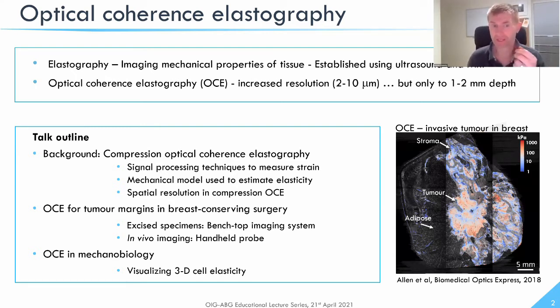In the second half of the talk, I'll then describe some of the work we've been doing to perform margin assessment in breast conserving surgery, and just touch on something which is a little bit more recent, but something that we're accelerating quite a lot in the group, which is to try and apply this technology to mechanobiology.